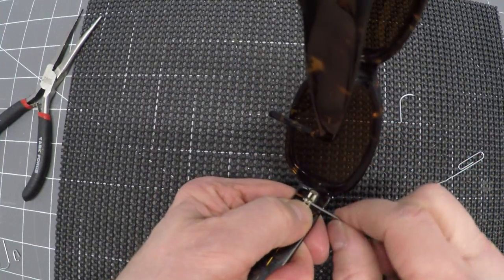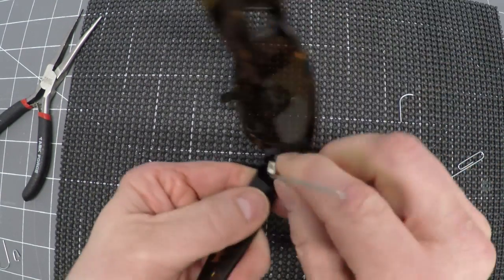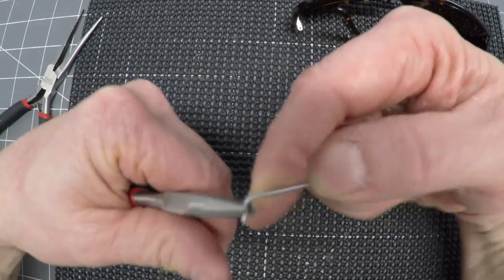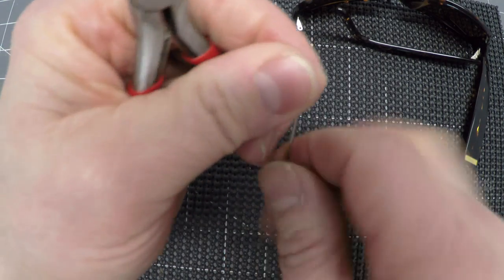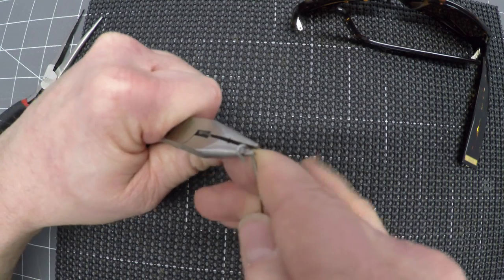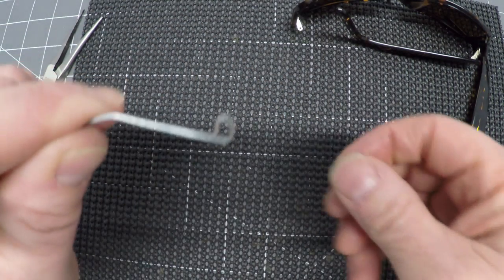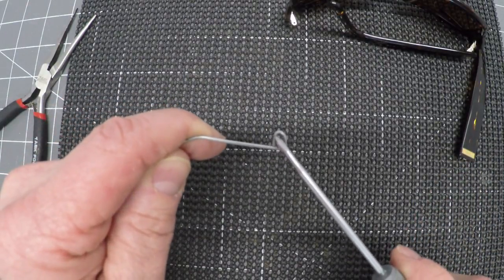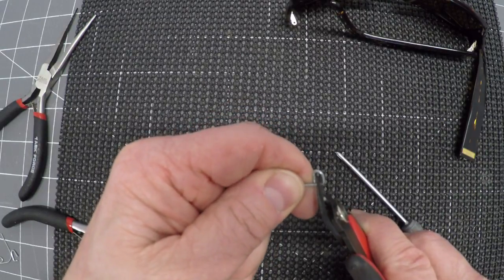Then you take the glasses and very carefully bend, so I know that's right where my arc is gonna be. Set the glasses to the side. Okay, now you're just gonna take a pair of pliers and you're gonna bend it around like this. And then this is where you want to finish the bottom of the D. Pull up here a little bit and then you want it to be flush with the bottom. And see, you got a little bit of a D there. So when you make your cut, you want to make it just inside the side of the D right there. These little flush cutters are really good for this kind of thing.